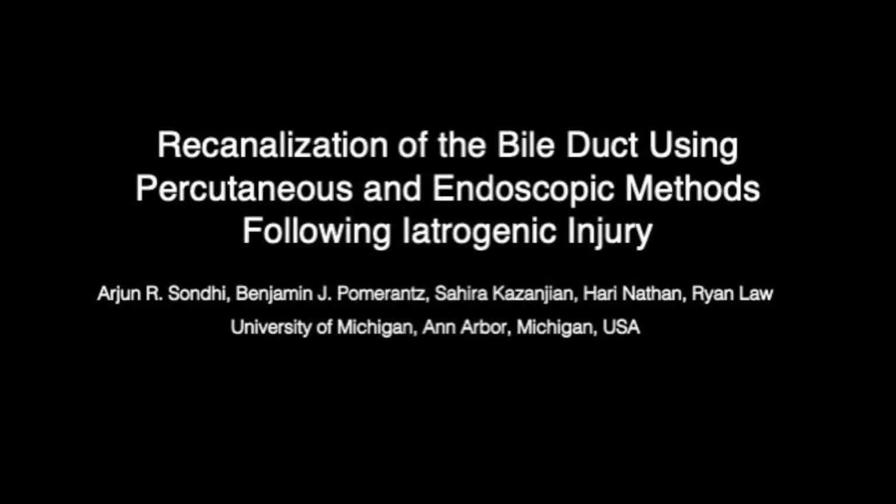Recanalization of the bile duct using percutaneous and endoscopic methods following iatrogenic injury.